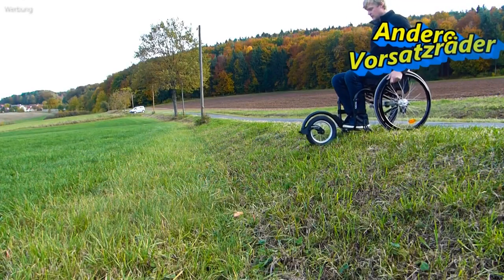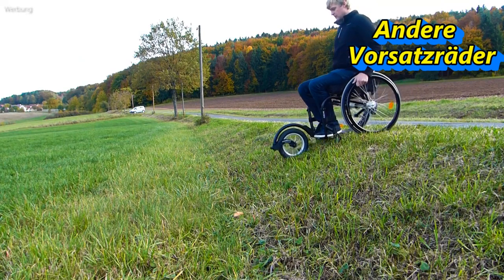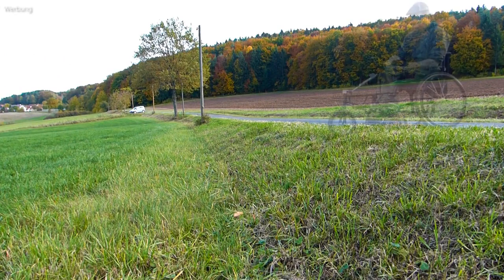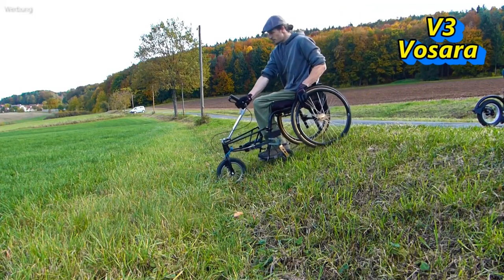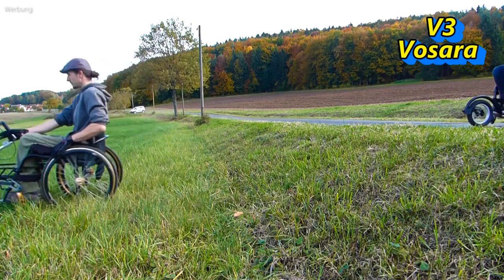You need trunk stability to go downhill, otherwise you fly out of the wheelchair. For me, this maneuver would not be possible with the other bike. With the Fossara it looks different — thanks to the one-hand handlebar, I can support myself and brake the front wheel, so going downhill is a safe and easy thing.